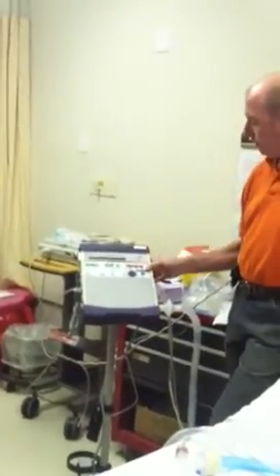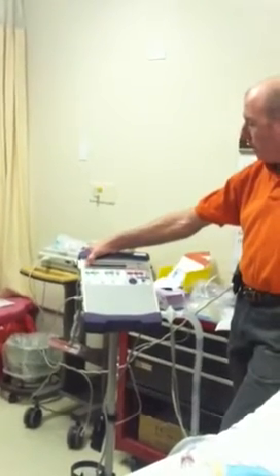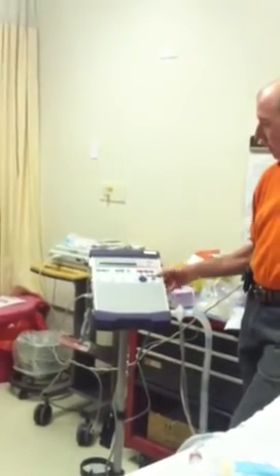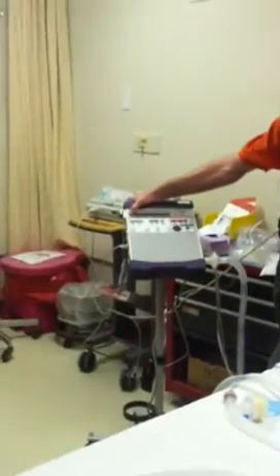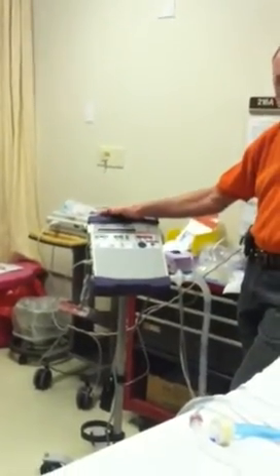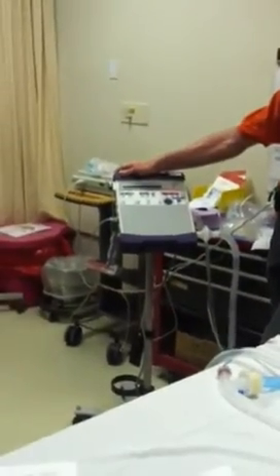Then we've got minute volume, tidal volume, IE ratio, inspiratory, expiratory. These are all things that we keep up with. And if I hold this down for 3 seconds, there are other parameters in there that I can go into, but that's nothing that y'all need to know about. I don't need to go in there and mess with it.